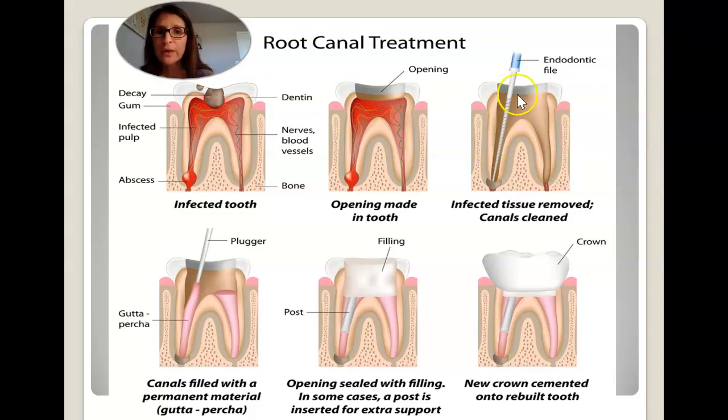So we're going to be squirting some of that solution, some of that sodium hypochlorite, into these canals, and the reason it's being used is because it helps to cleanse, it helps to dissolve any debris that might be left in here. It helps to deodorize. It is also an antimicrobial agent, so it helps to clean out the canals very, very nicely.